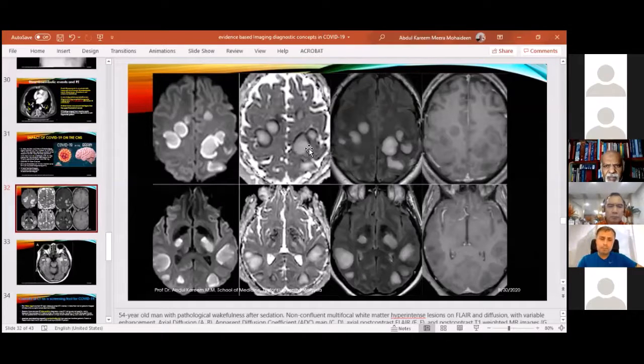Around the dead tissue, there will always be hyperactive parenchyma with hyperactive vessels. So the vascular supply will be more, even in a normal infarct. When contrast is injected, the contrast flow will be increased in that area. That is called a ring enhancement because it is only in the periphery.